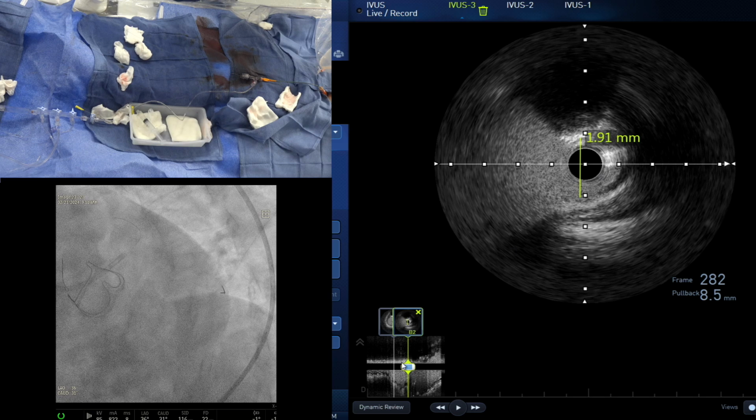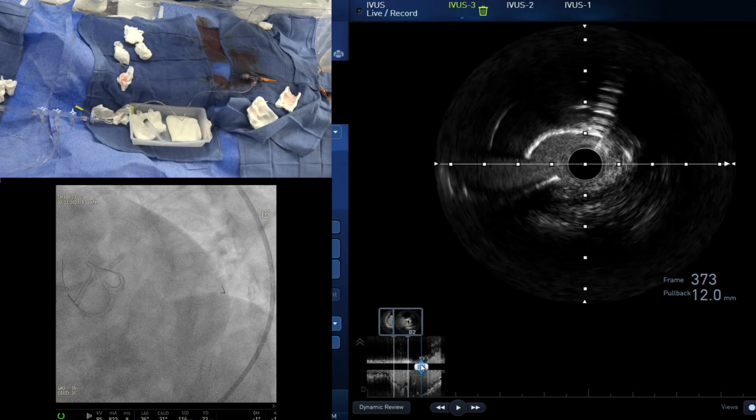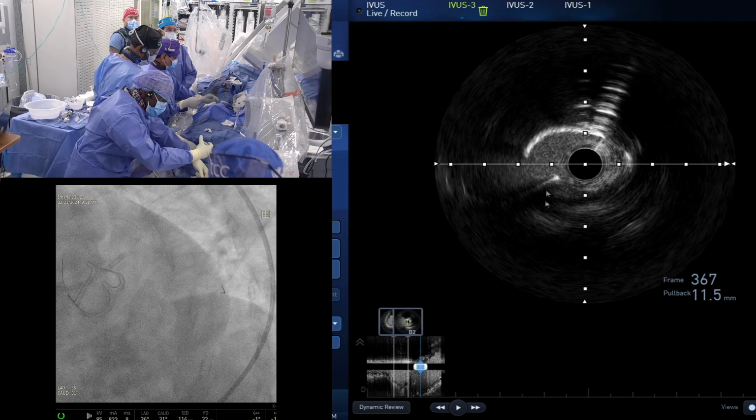Yeah. I would just balloon this now. Okay. Cutting balloon or regular balloon? Go back to the distal left main. Yeah, this is the distal left main. The surface is shaped, but still, because of the acoustic shadow, we cannot see behind. But still, like a huge plaque burden, a calcium burden in the distal left main.